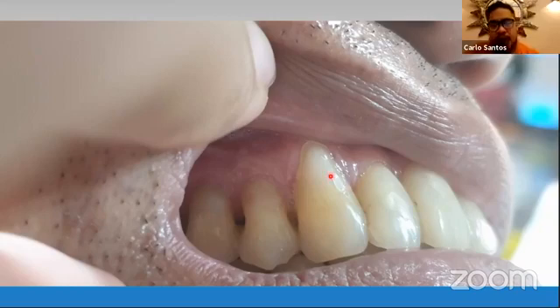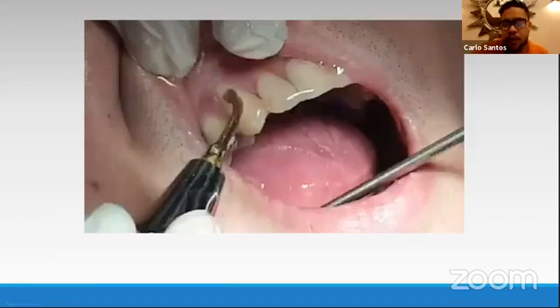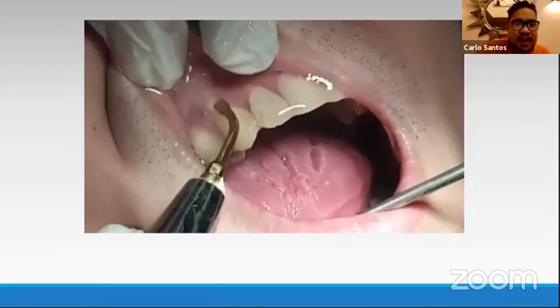And then here we used the Woodpecker piezo surgery machine to remove the composite because we don't want to damage the tooth. Excessive damage will occur if you use your burr rather than this. It's really precise, it really takes out the composite without damaging the dentine. This is how we use it, and with just that, you remove that thin layer.